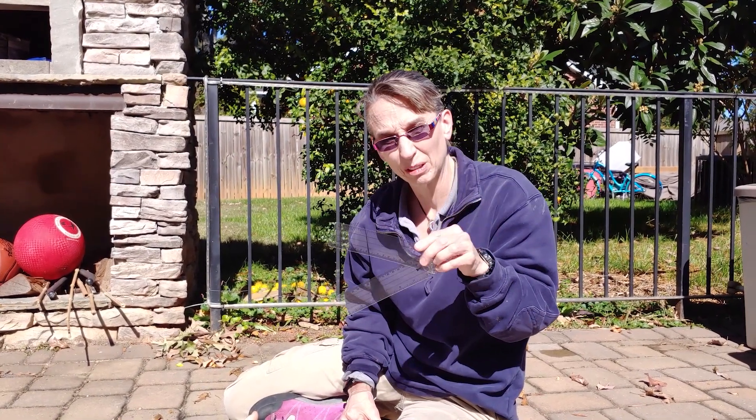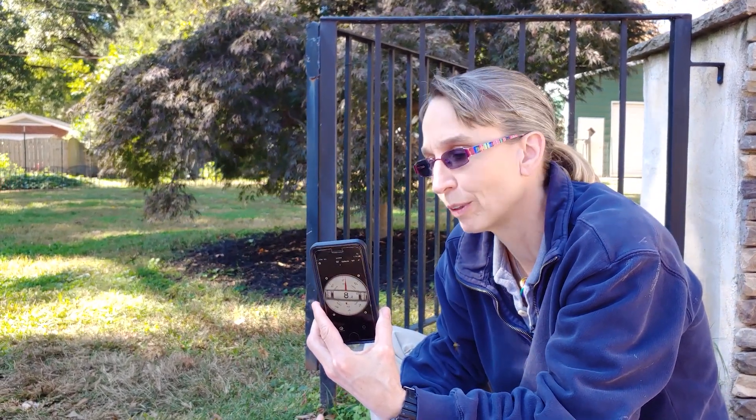You might not have one of these handy-dandy things, so I'm going to show you how to do it with an app. It's not quite as accurate, but it is a way you can do it. I use the Clinometer app — C-L-I-N-O-M-E-T-E-R — and it's an iPhone or Android-based phone app.